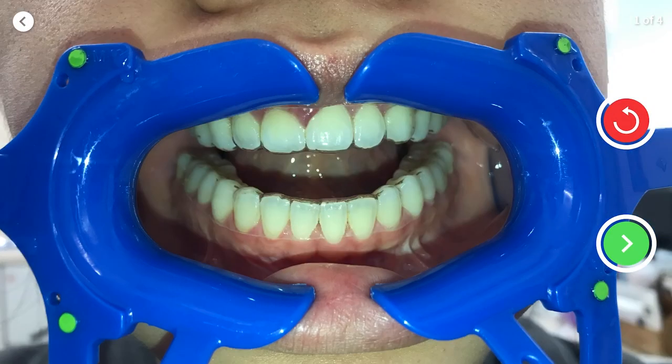After each scan, it will play back a clip of your scan. If you're happy with the scan, press the green tick to proceed. If you want to retake your scan, press the red redo button.